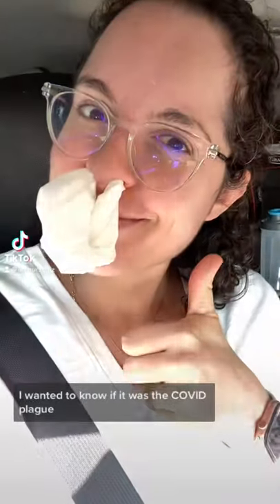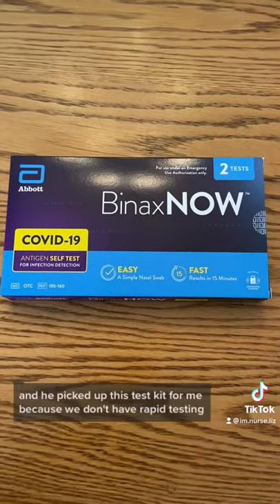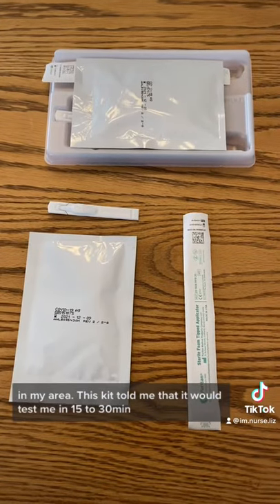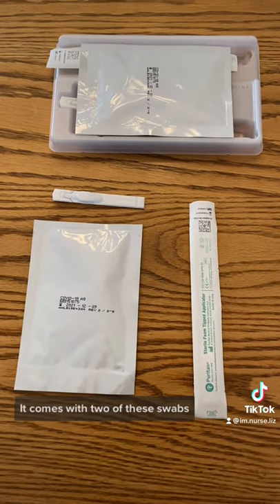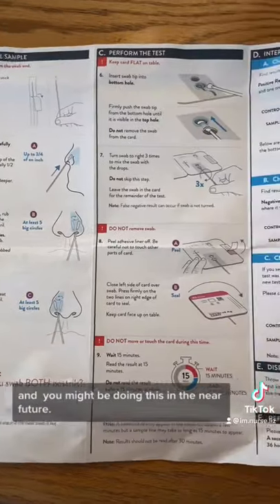This week I got the plague. I wanted to know if it was the COVID plague, so I sent my husband to Rite Aid and he picked up this test kit for me, because we don't have rapid testing in my area. It told me that it would test me in 15 to 30 minutes and I would have a response. It comes with two swabs and I thought I'd walk you through it, because it's interesting and you might be doing this in the near future.